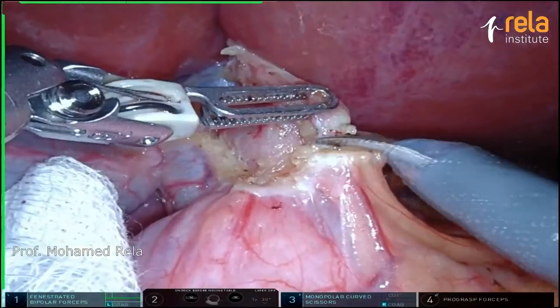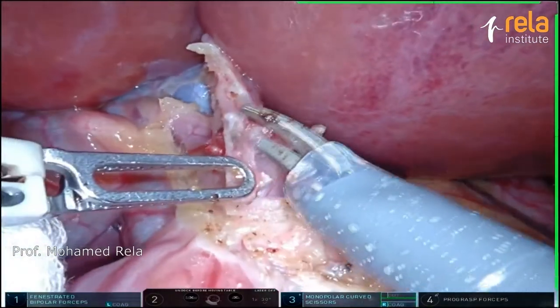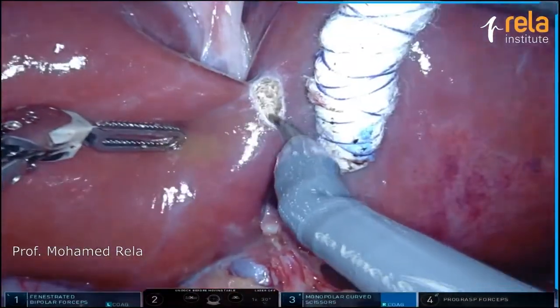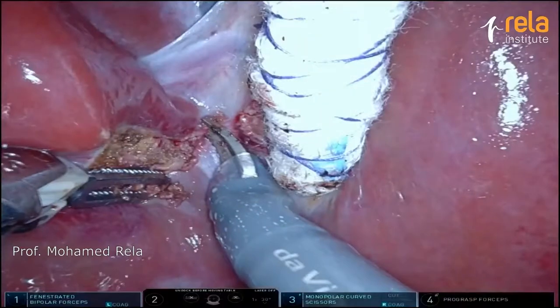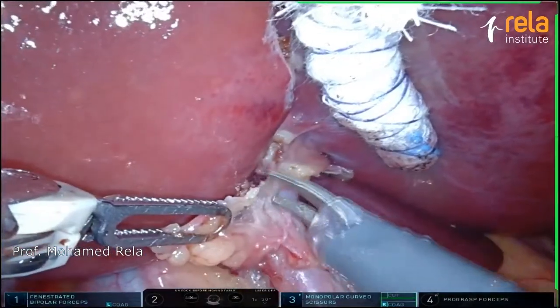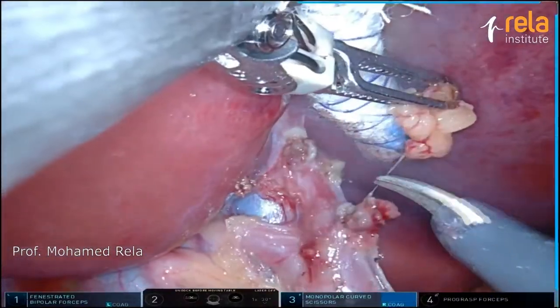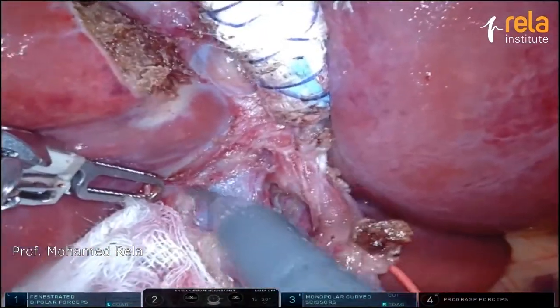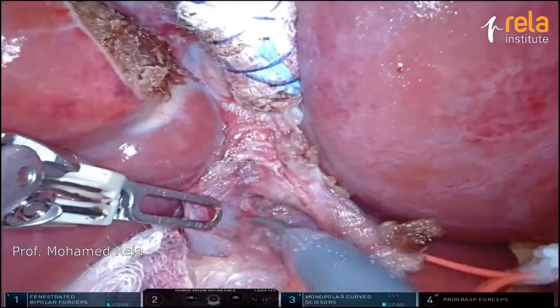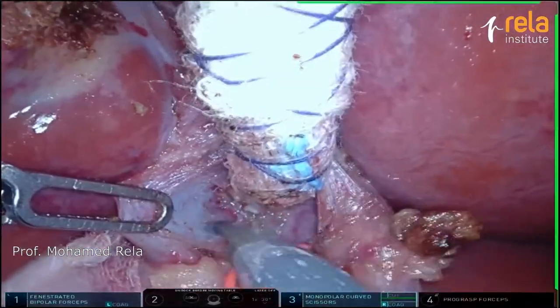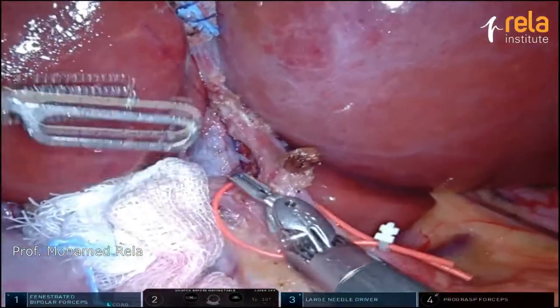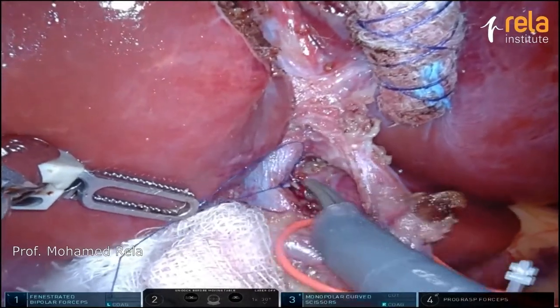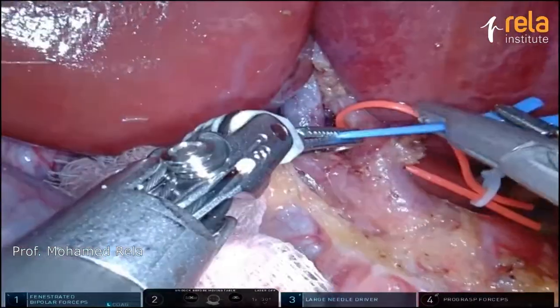This was a slightly older camera — the previous video used the more recent replacement camera. The lymphatics around the left hepatic artery are divided and there's a sling around the left hepatic artery. Now it's the left portal vein — you can isolate it and see the caudate branch there, which can be ligated and divided. And a sling around the left portal vein — this is more straightforward.